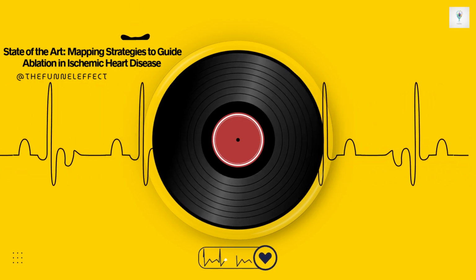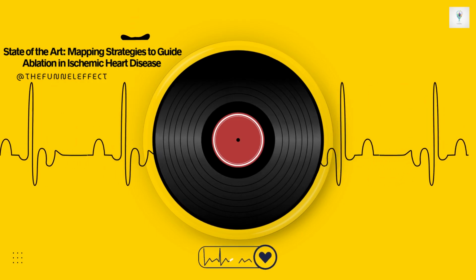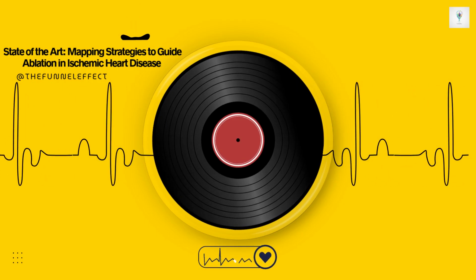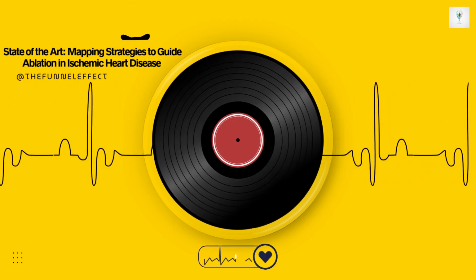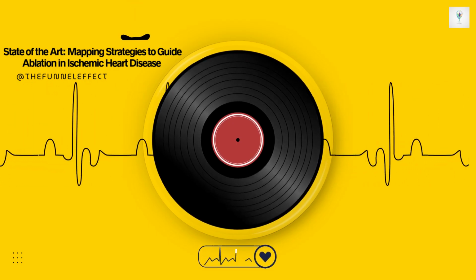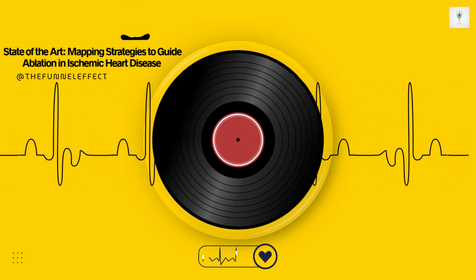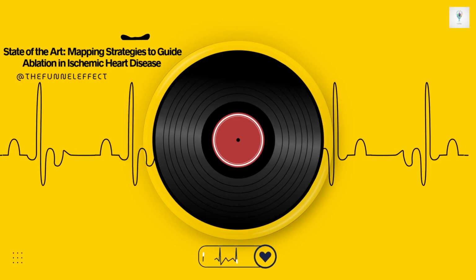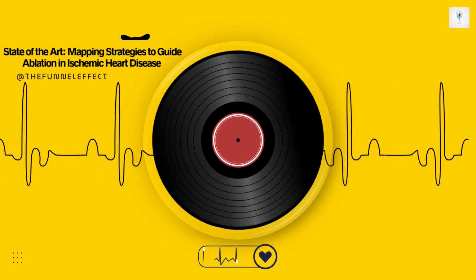Exactly. If you have an area with okay bipolar voltage, say above 1.5 millivolts, but the unipolar voltage in that same spot is abnormally low, that's a big red flag. It strongly suggests there's significant scar deeper down, intramural or maybe even epicardial scar, lurking beneath that preserved endocardial rim. This border zone area, sometimes called the penumbra, is often where the most critical parts of the VT circuit are actually located. Unipolar mapping helps us paint a more complete transmural picture of the damage.